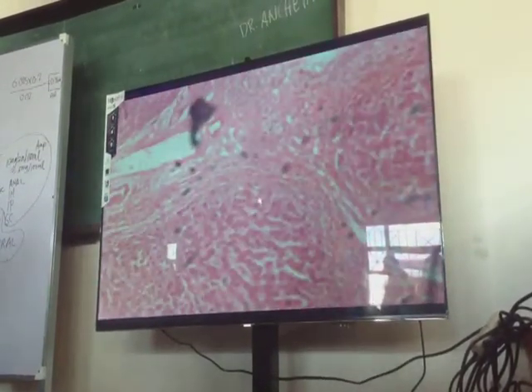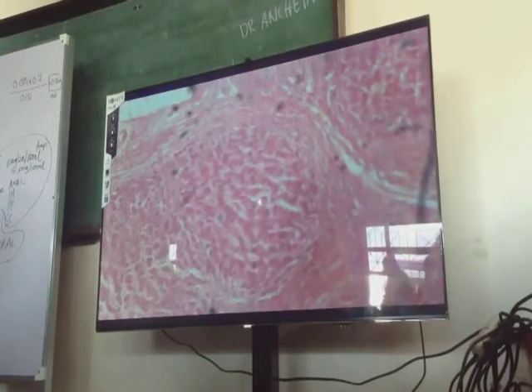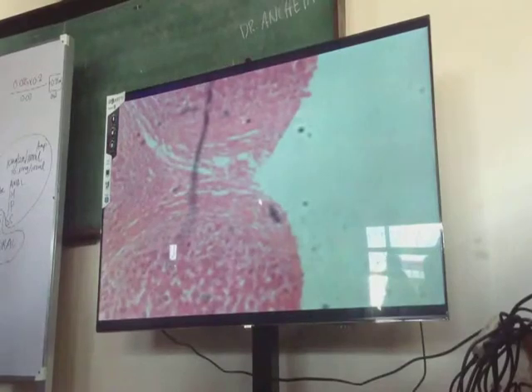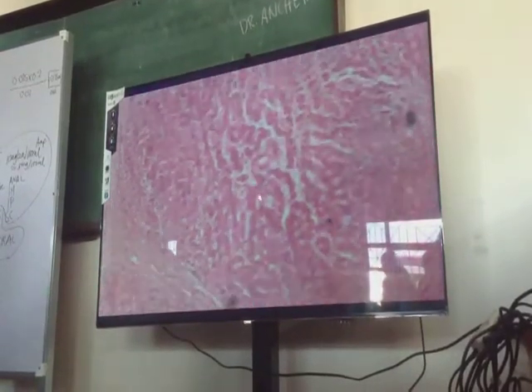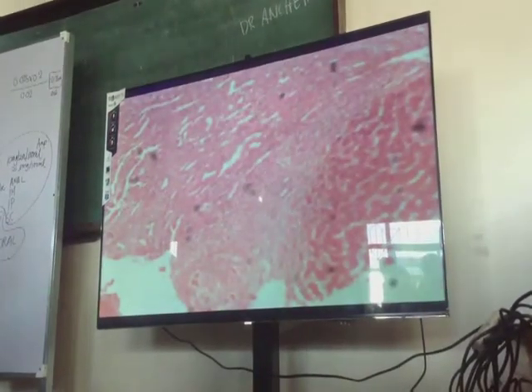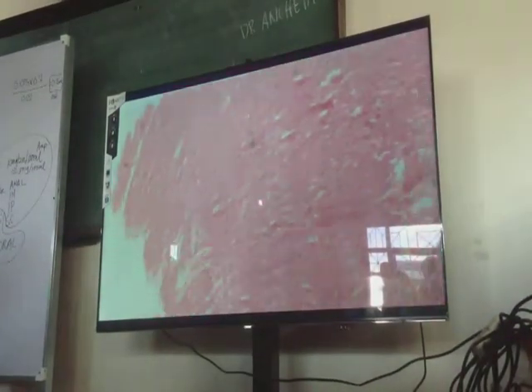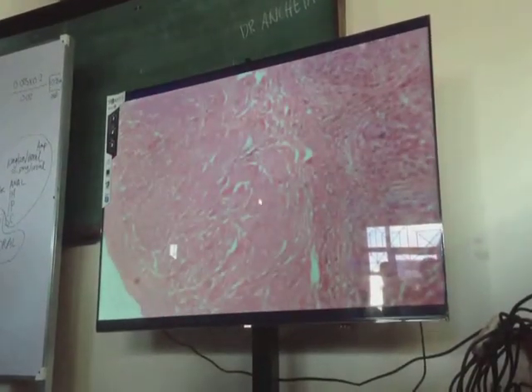However, the diagnosis is sclerosing cholangitis, so that we should be able to see bile duct that is chronically inflamed and surrounded with fibrosis. As shown in Robbins, what is the characteristic pattern of abnormality?